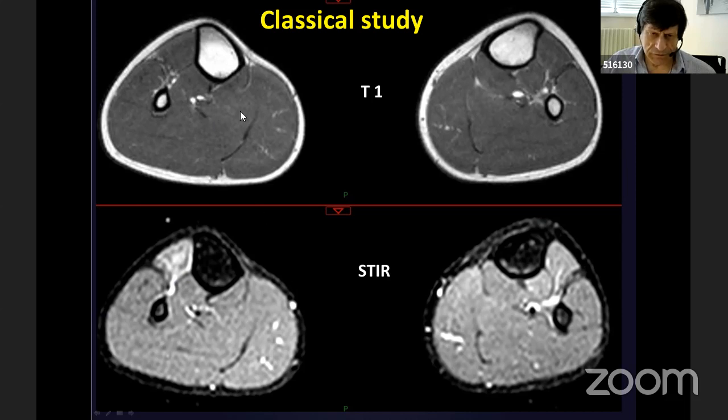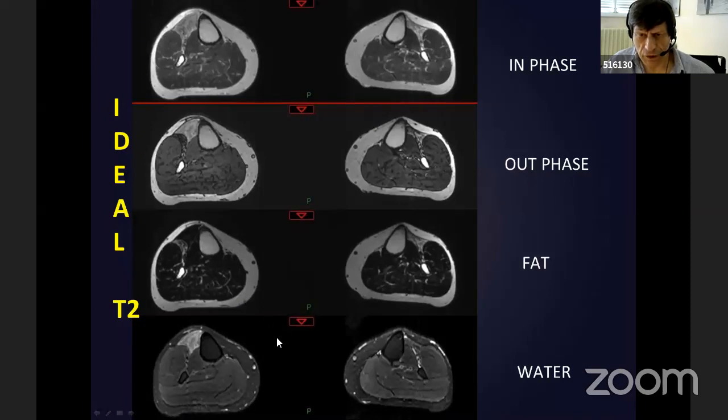These slices are performed at the same level, and this patient has FSHD disease in an early stage of inflammation of the tibialis anterior, previous to fatty infiltration. Another patient with facioscapulohumeral dystrophy, but in a late stage.